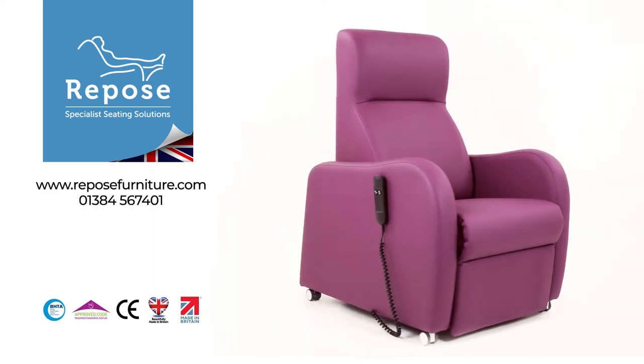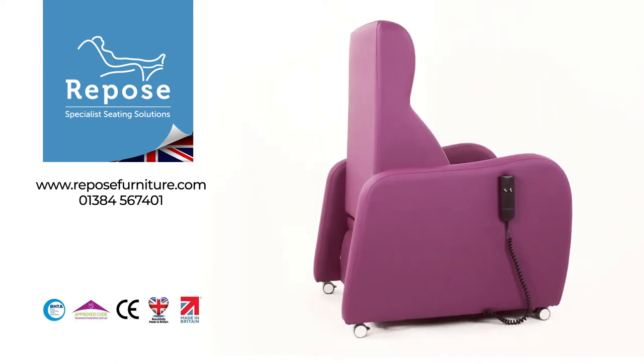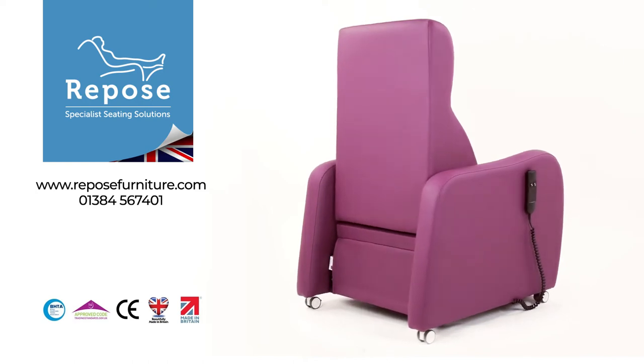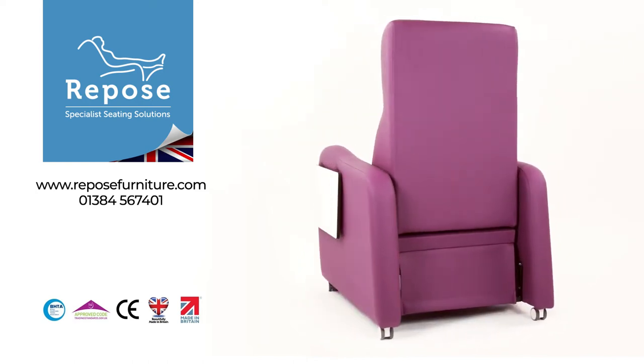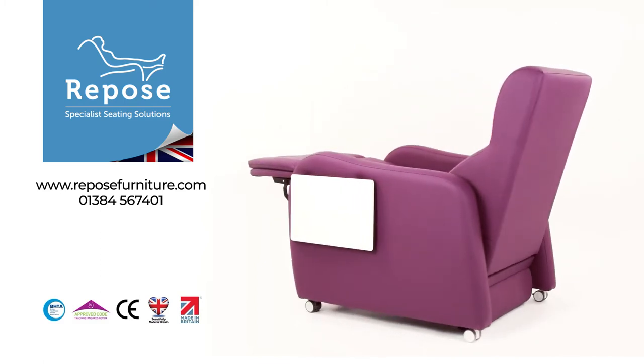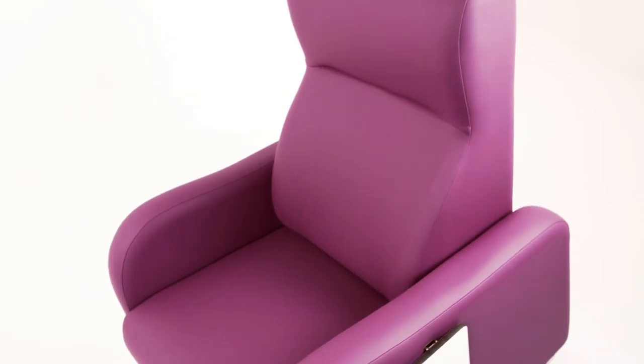Introducing the Stamford, part of the Repose Furniture range of hospital and healthcare chairs. Designed for general comfort, this chair has limited seams and simple lines to assist with infection control, and is suitable for both general ward and daycare use.